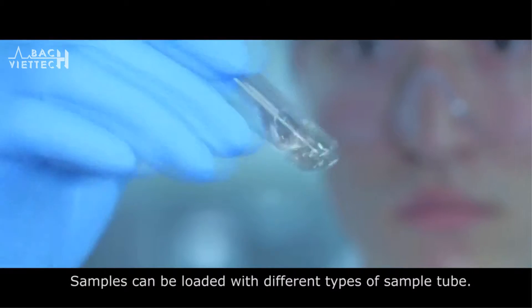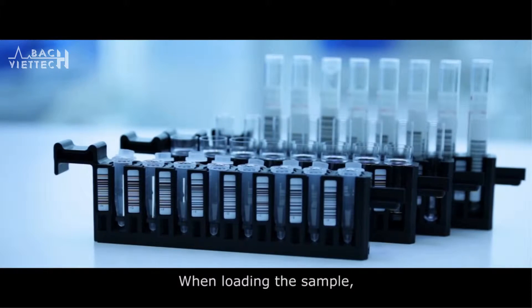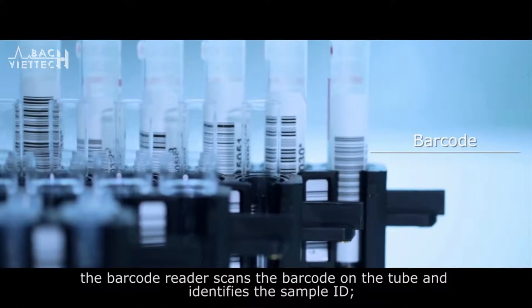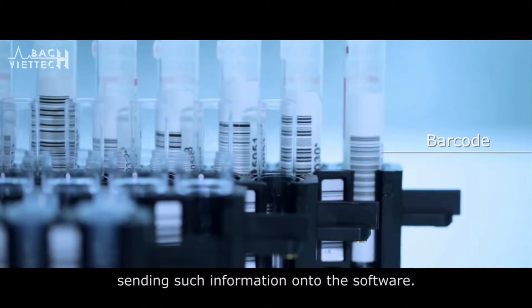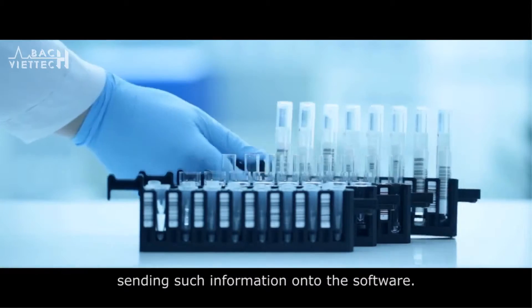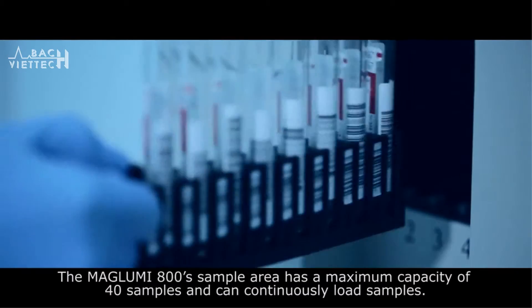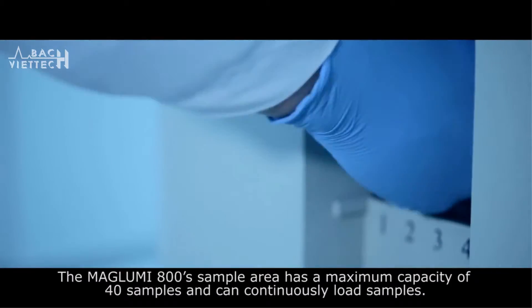Samples can be loaded with different types of sample tube. When loading the sample, the barcode reader scans the barcode on the tube and identifies the sample ID, sending this information to the software. The Maglooby 800 sample area has a maximum capacity of 40 samples and can continuously load samples.